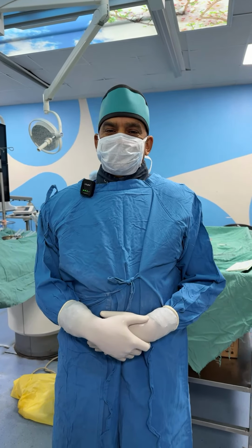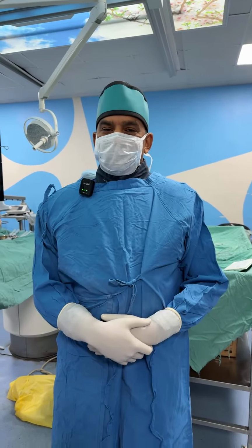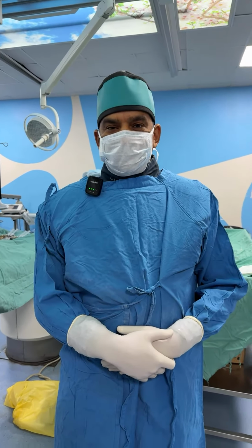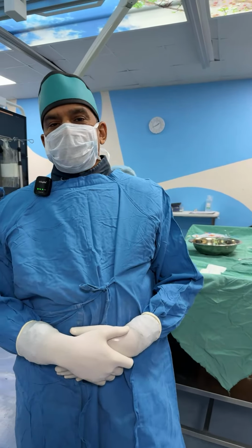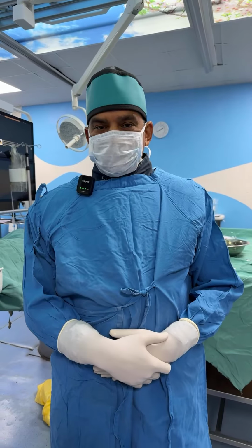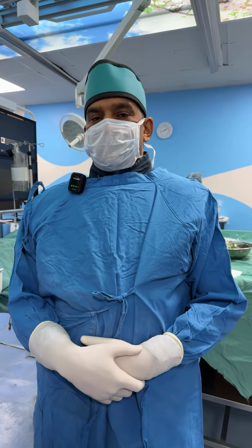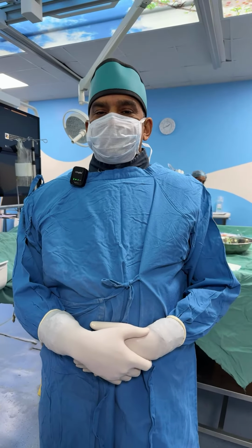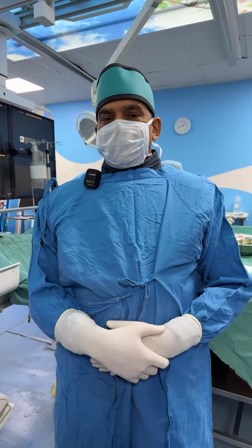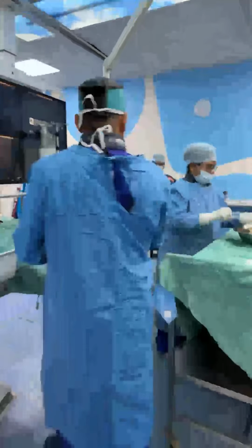A patient who is having heart failure, multiple uterine fibroids and bleeding from those fibroids, so massive pervaginal bleed, and she is not suitable for a surgery, hysterectomy or myomectomy. So, that is the reason we are doing a uterine fibroid embolization to stop the vaginal bleeding and hence to basically take care of these fibroids and pervaginal bleed. Let us look at it.